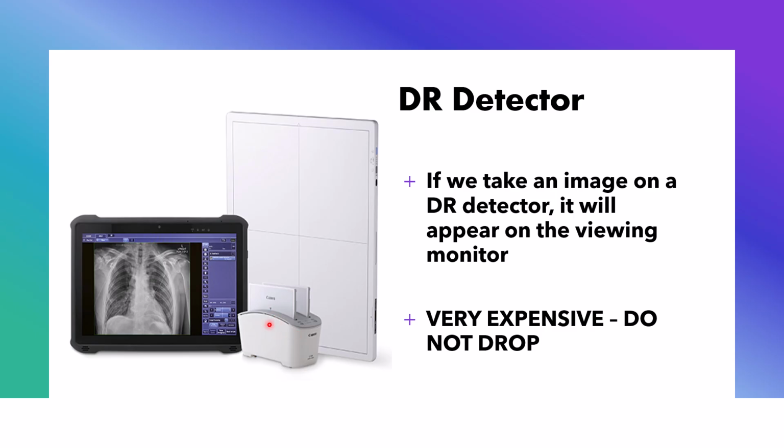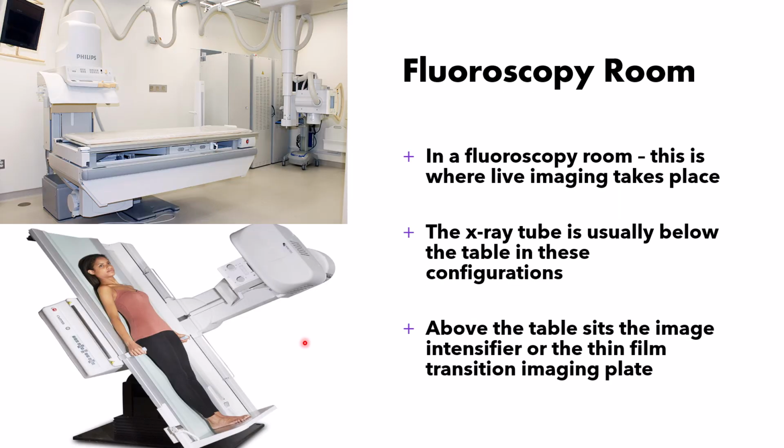The thing about it is, this is just the charger. This is not the processor. This is just charging the plate. Again, you can see this in our lab. And then it sends the information to some screen. The thing with this is, it's very expensive, as much as a nice car. So you don't want to drop them.